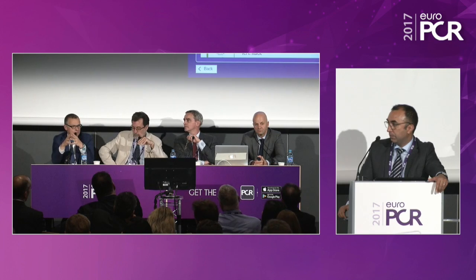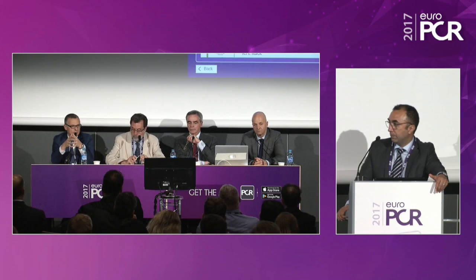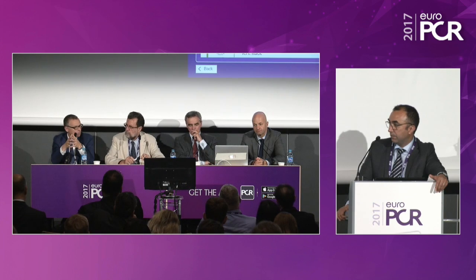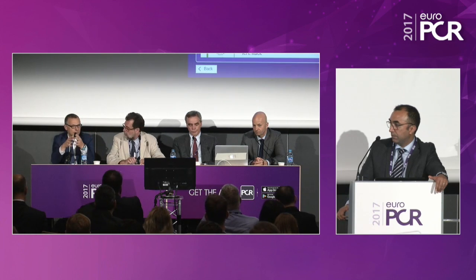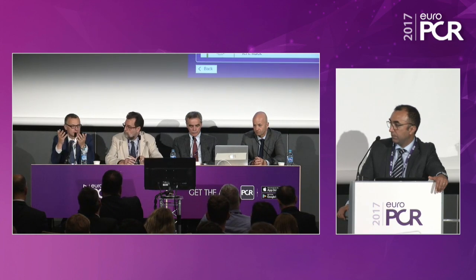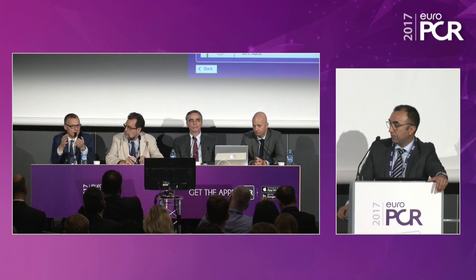Combination of therapies is going to be probably one way of solving problems in transcatheter mitrals. Obviously, we have had all the experience of failed procedures in both directions. We have had Cardioband patients failing and treated successfully with leaflet repair, and the opposite. You have seen leaflet repair MitraClip cases failing, which we have been treating with Cardioband effectively.